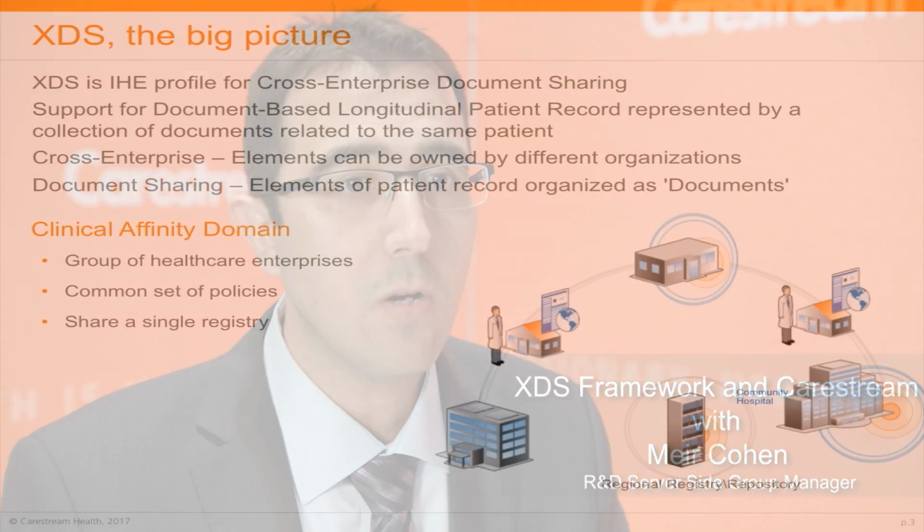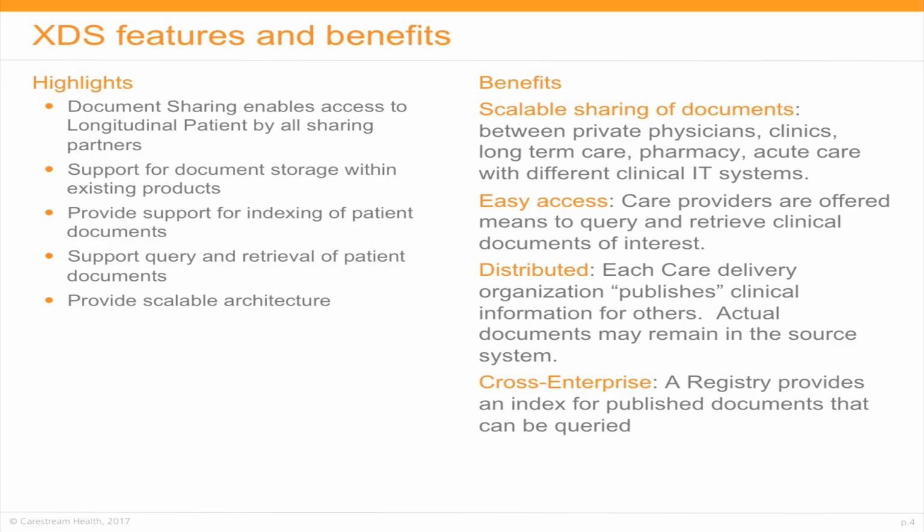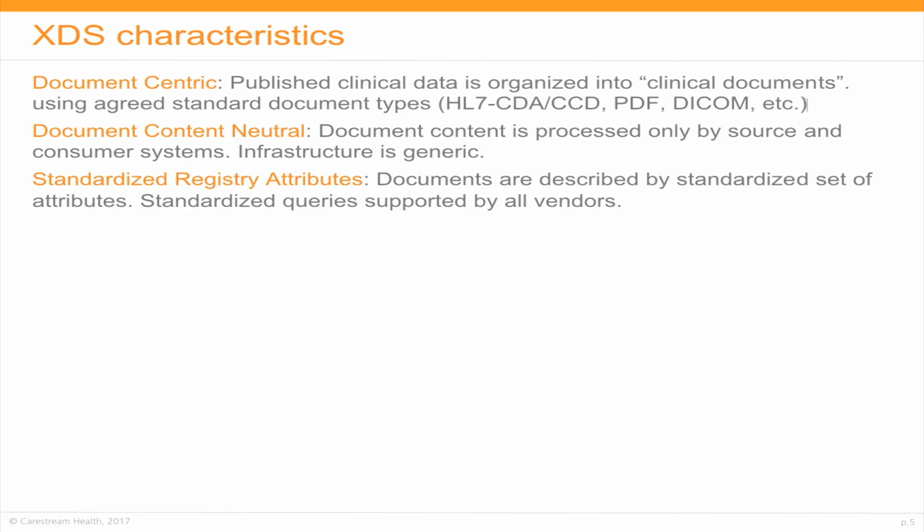When we talk about XDS, it's all about sharing clinical data throughout the community, beyond the specific hospital. When you talk about sharing data for imaging, there is XDS-I, cross-enterprise document sharing for imaging. The XDS-I version enables us to share data over HTTP protocols that are suitable for both server and mobile.